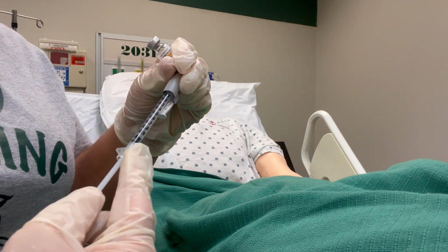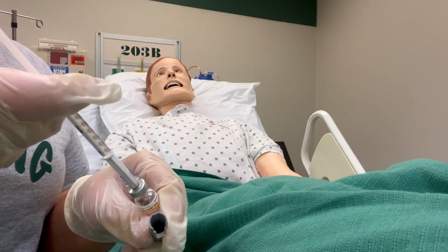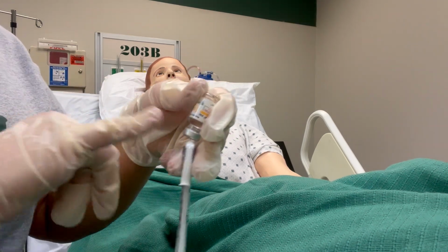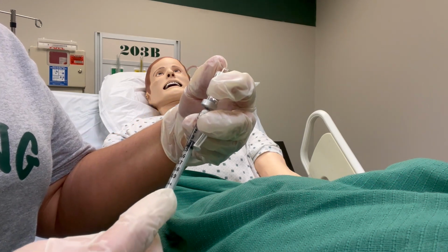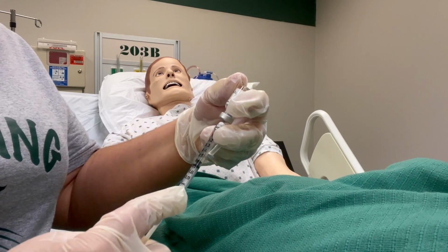So I'm going to pull it down to 1, remove my cap, and inject the air. Then remember, you're going to invert the syringe. I'm going to be cautious not to touch my needle, and I'm going to pull up. You want to do it kind of slow so you don't get a bunch of air in there. So we're going to draw this up. Doing okay, Mr. Smith?